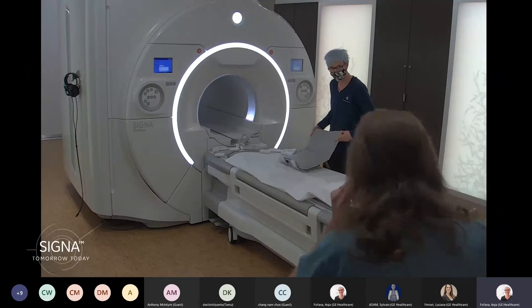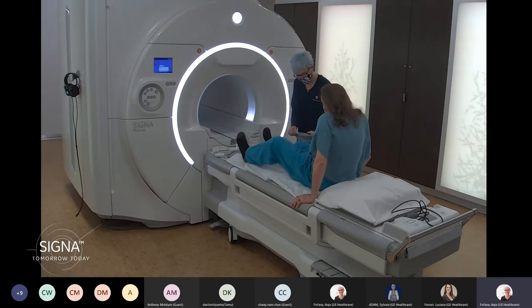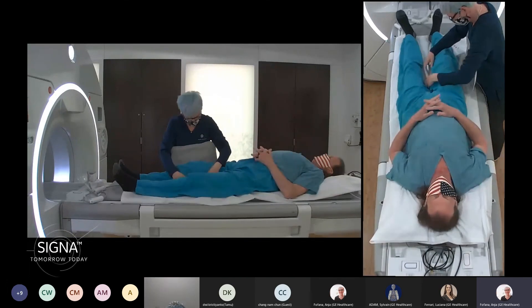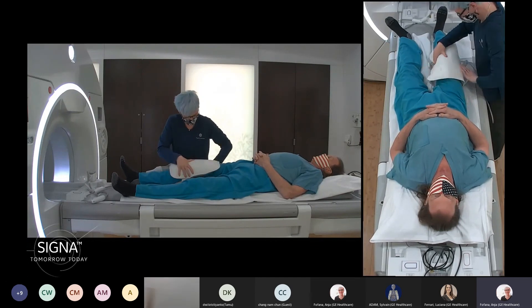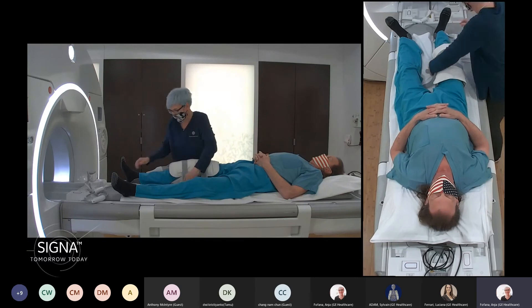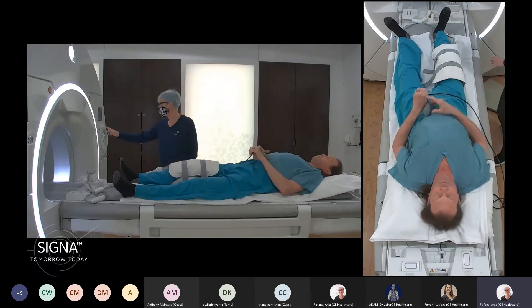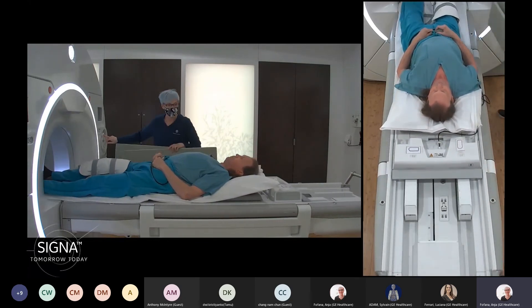Alright, come on over. We'll do your knee — head over here, pull your right knee into that coil. Let's check where your knee is. You can use the tele-touch feature on the coil. It's already connected. Are you comfortable? Awesome. Here's the squeeze ball. Then we use the tele-touch feature on the coil and go ahead and start the scan.